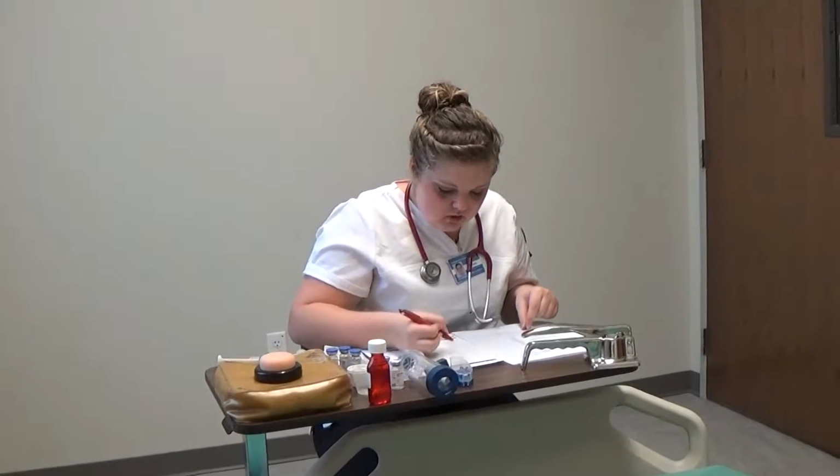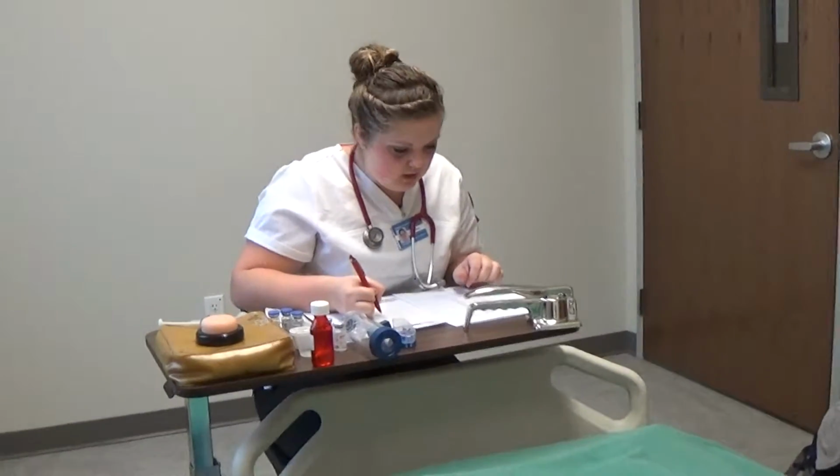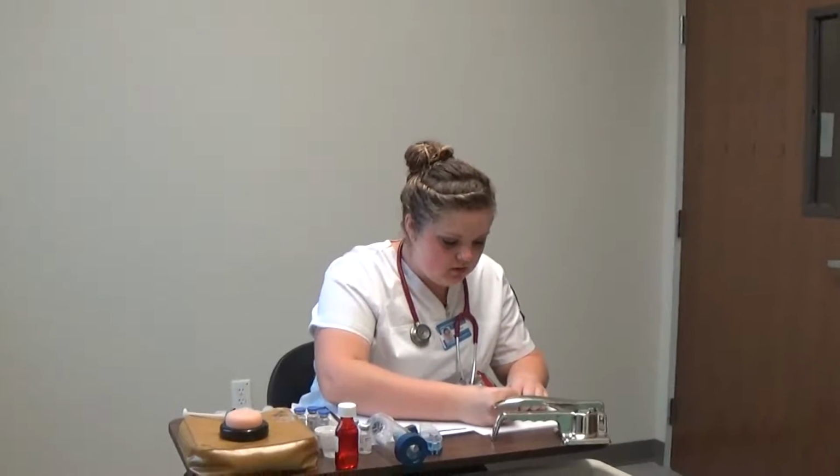Alright, let's see, I also have a tuberculosis test with 0.1 milliliters ID now.